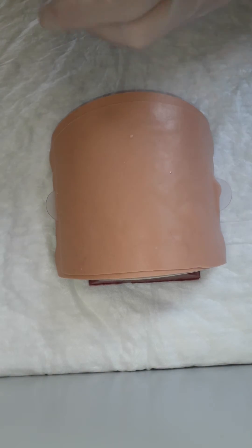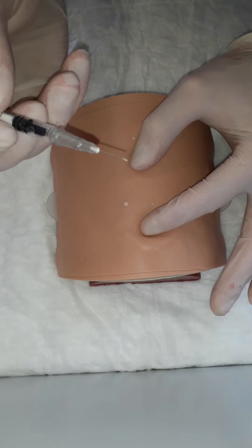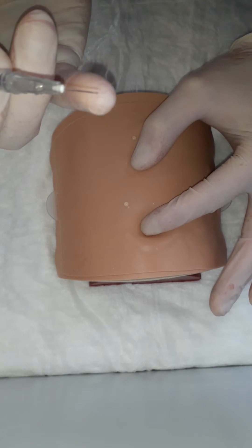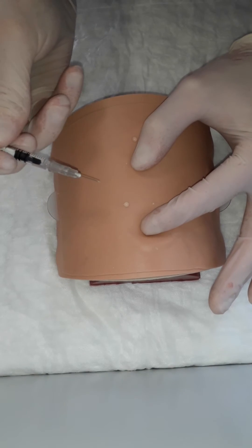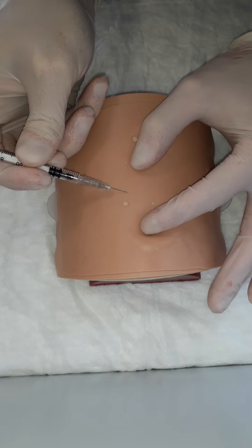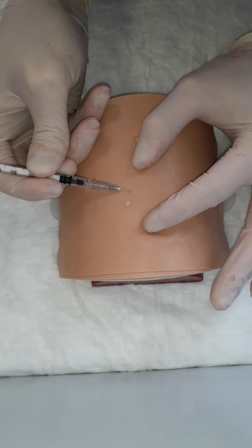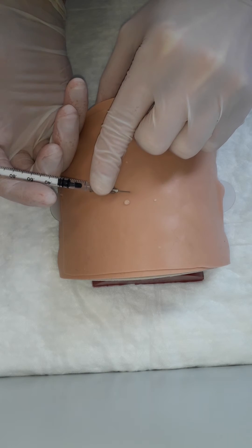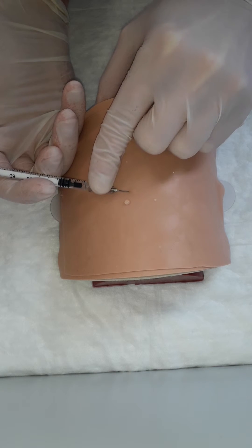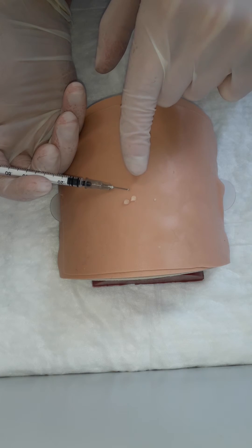Now, the patient's skin is dry. We stretch it a bit. We look at our needle tip — the small hole at the tip should look upwards. Then we inject at an angle of 10 degrees, a very narrow angle. As you're in, you make the injection. And you see what's happening? A bleb is forming here, which is a good sign, which means you are in the correct position.